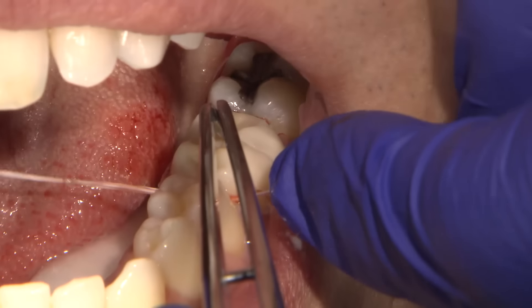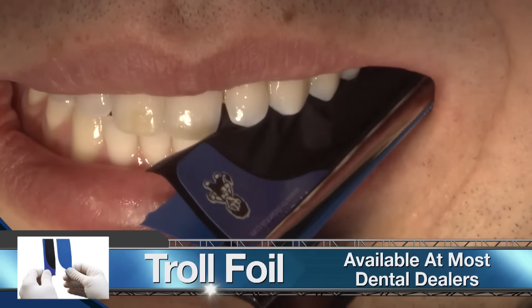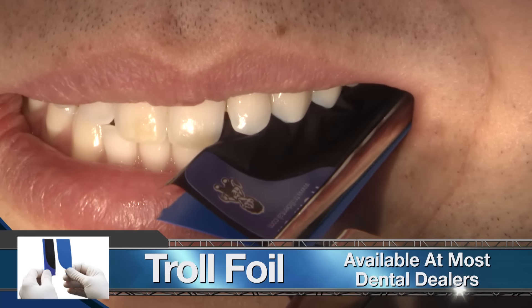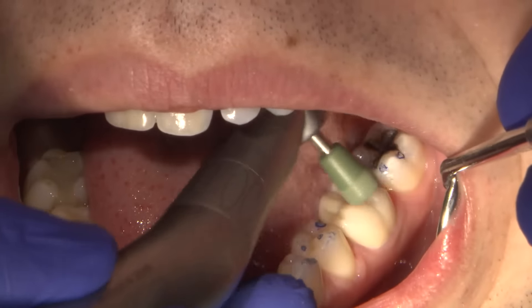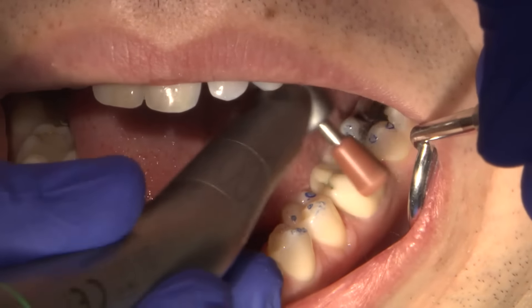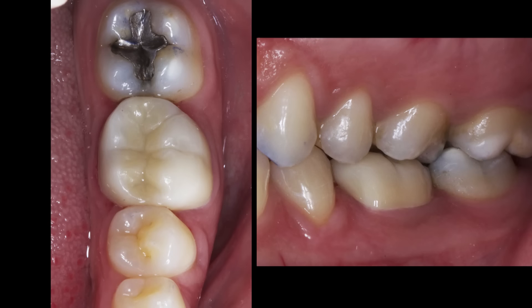Once the restoration has been cemented, we will then check the occlusion and make any necessary adjustments to those areas. We'll check it with articulating paper, have the patient bite down in centric and also in excursive movements, and make any adjustments as needed. Once the adjustments are completed, I'll polish the adjusted areas using the special Bruxer polishing wheels. Here is the completed restoration. We were able to complete this crown by sending our digital impression, taken with the three-shaped Trios 3 scanner to the lab, allowing them to fabricate the patient's Bruxer crown using an entirely digital workflow. We're pleased to provide this patient with a great functional crown and also satisfying his request for a much improved aesthetic appearance.